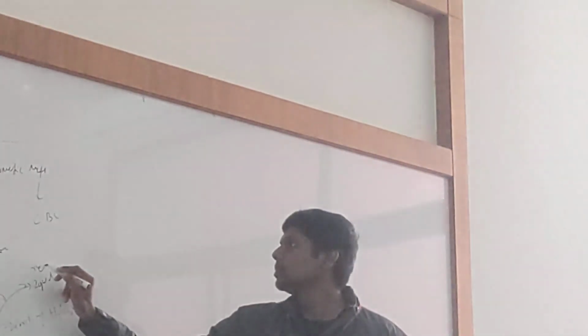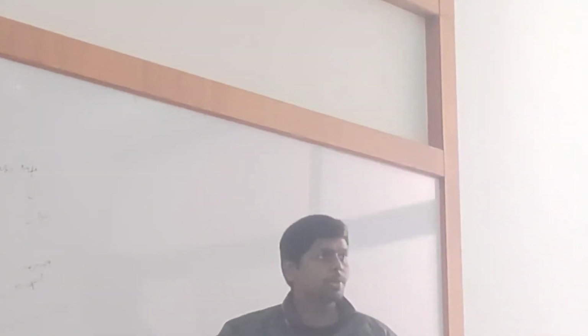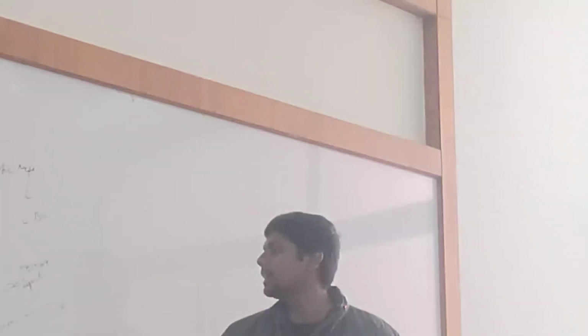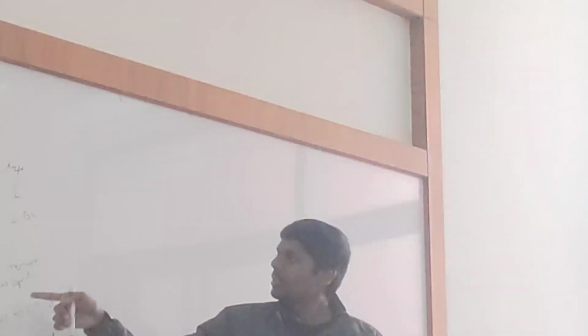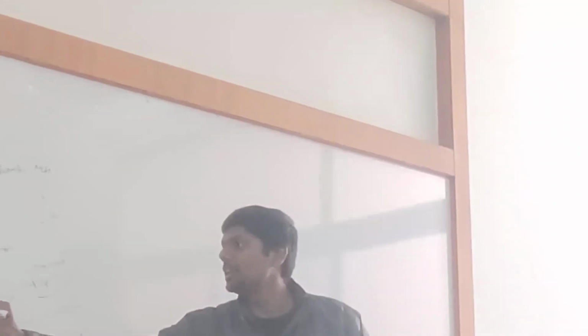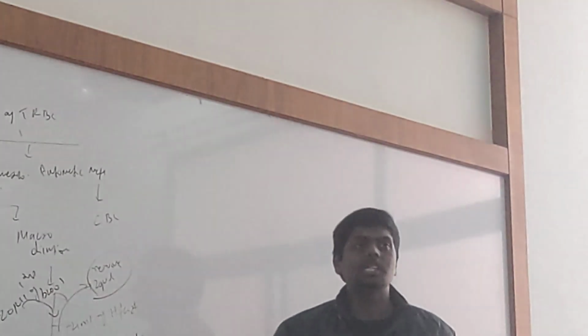So the overall volume of the fluid will be 3.98 ml, because we removed 20 microliters. Now to this test tube, we are going to add 20 microliters of blood, or 1 drop of blood.